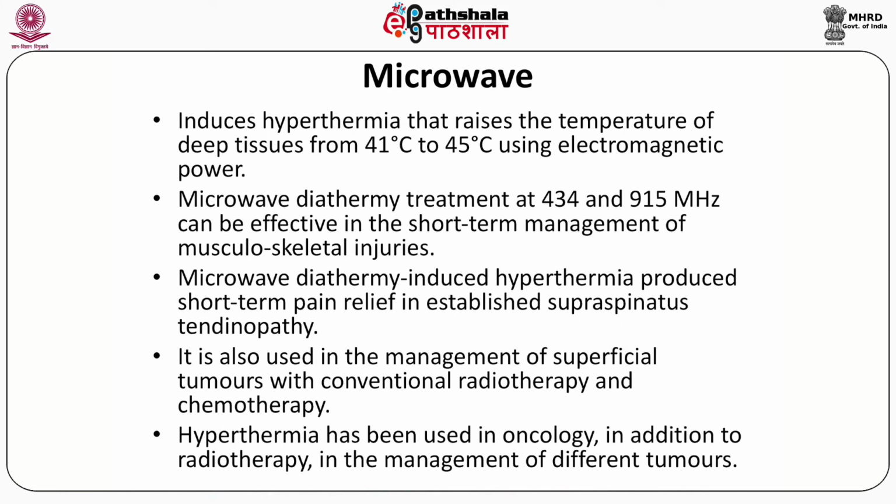Microwave diathermy induced hyperthermia produced short-term pain relief in established supraspinatus tendinopathy. So supraspinatus tendinopathy is a commonly used indication for this microwave diathermy. It is also used in the management of superficial tumors with conventional radiotherapy and chemotherapy. So along with the conventional radiotherapy and chemotherapy techniques, superficial tumors can be managed by microwave diathermy also.